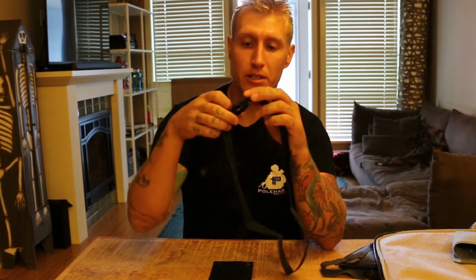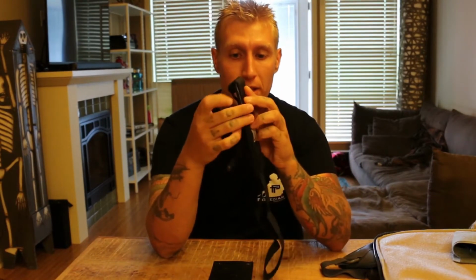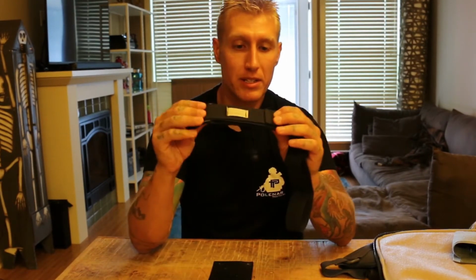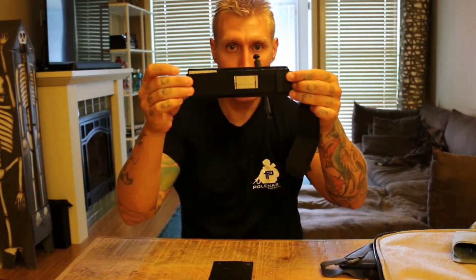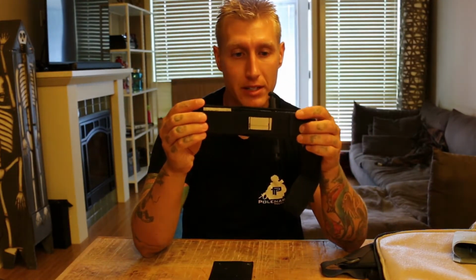So the way that I do it is I pull this end tight here so it's nice and flat and I don't have any extra strap. I run it down along the wide part of the tourniquet, and I want it to be the exact same length as the wide part of the tourniquet, or pretty close to it. So here you can see it's not the same width, but the same length as the wide part of the tourniquet here.